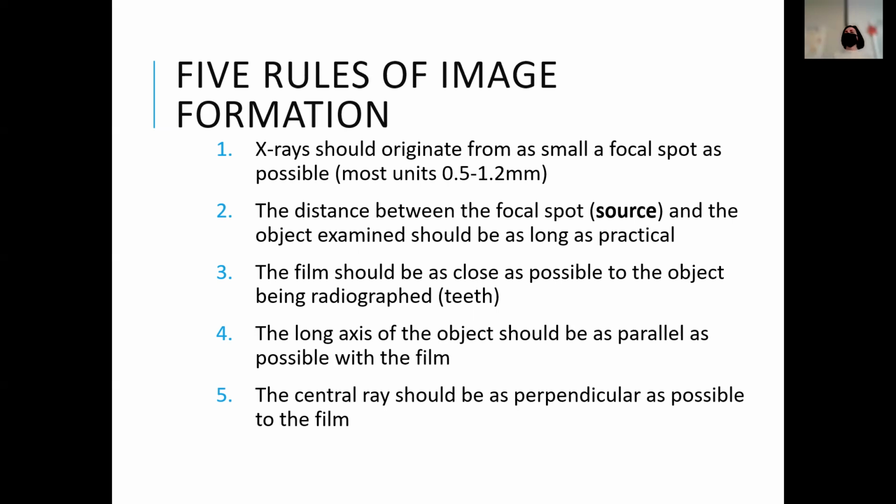to minimize your distortion. And then the last one, 5, the central ray should be as perpendicular as possible to the film if you're in parallel. So if your tooth and your film are parallel, your central ray is perpendicular. So those are your 5 hard and fast rules for getting the best diagnostic replication of the image that you're trying to take the picture of.